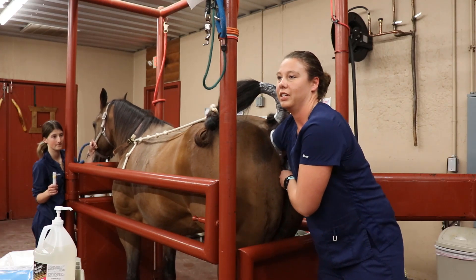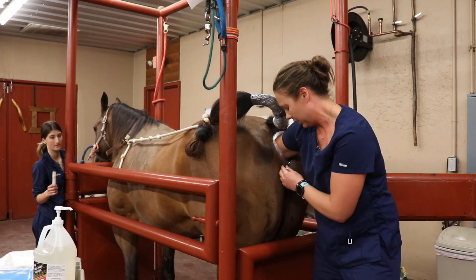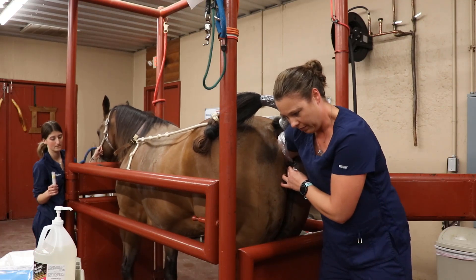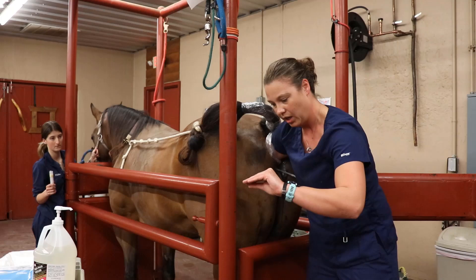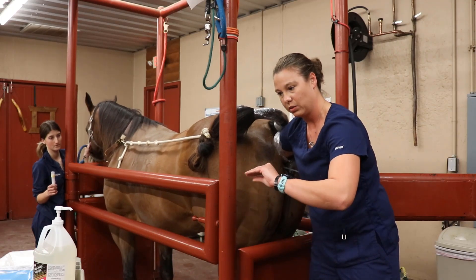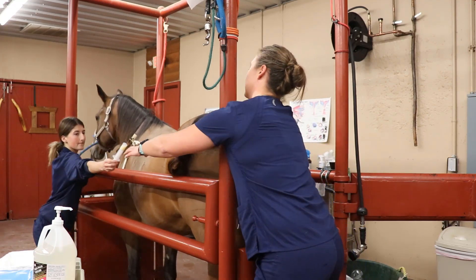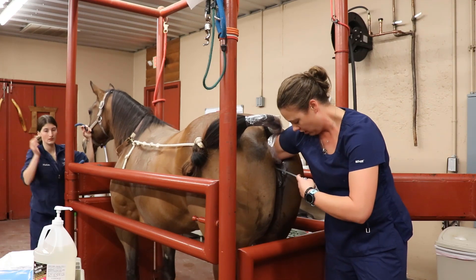You definitely feel it once it slides through. We were caught up on a fold there — you can probably see it, and I definitely felt it. Once it's comfortably seated in the uterine horn, I'm holding the uterine horn and the pipette in place with my hand that's in transrectally, and then I'll go ahead and attach her semen.